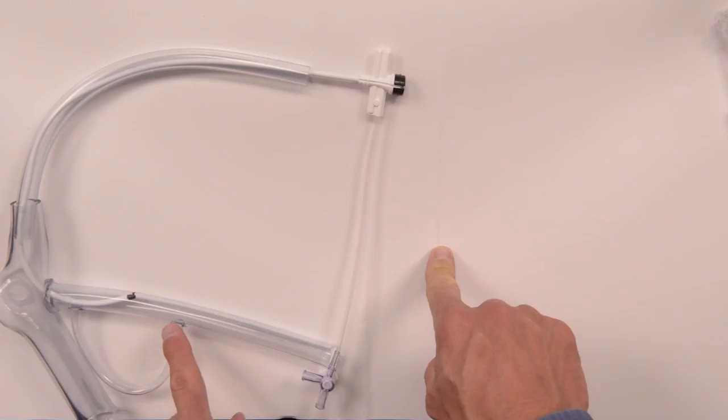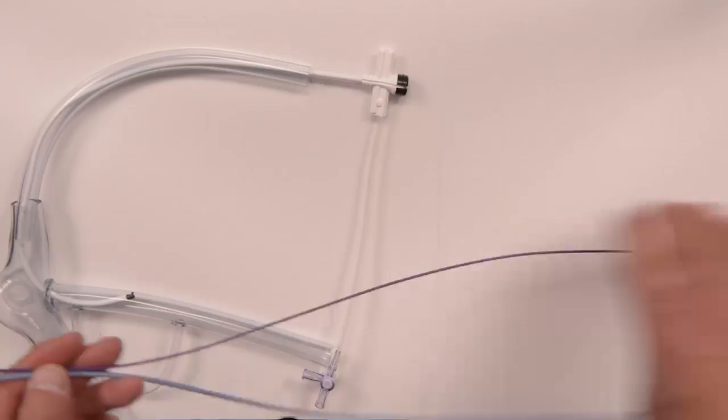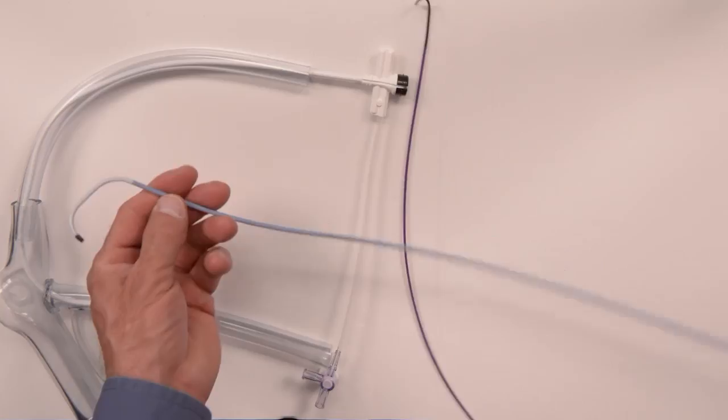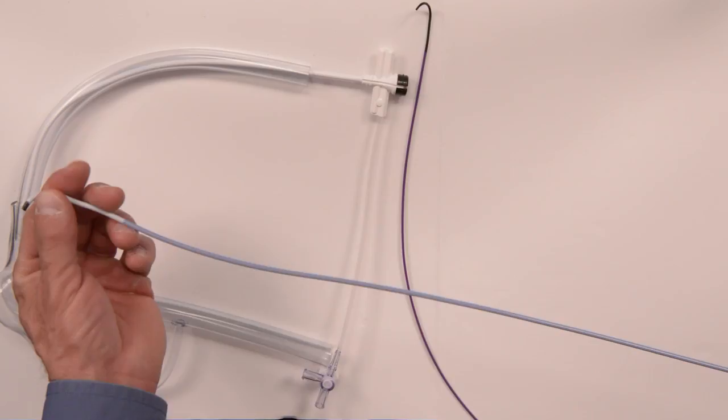Once we get to this point, the next step is the LVI. Within the LVI package comes two catheters. The first one is the LVI itself, which stands for lateral vein introducer. This is a seven French inner diameter catheter with a very soft atraumatic tip and a braided shaft.